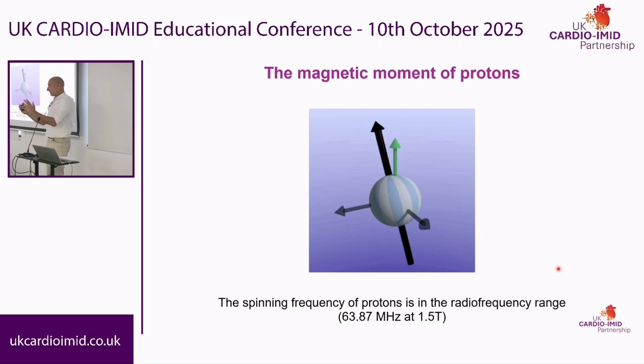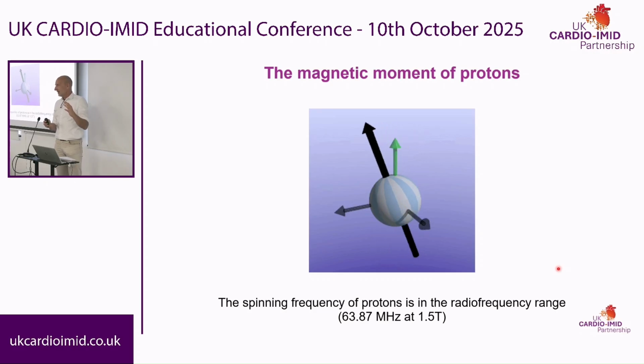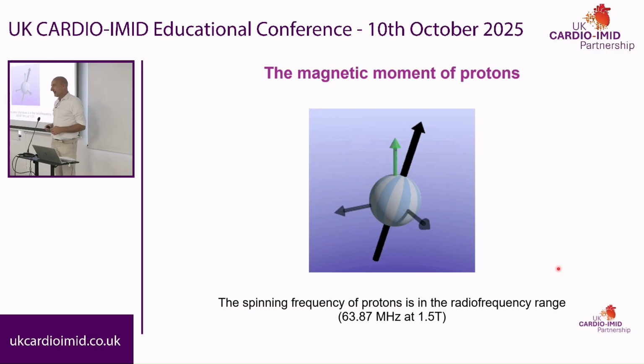So the first part of the MRI scanner is the very strong magnetic field, which we need to do what? Align protons with the magnetic field, so they're not all chaotic and don't give us any signal. You can't really work with that. Everybody doing their own thing doesn't work. Second thing of the MRI scanner is the RF pulse. So we've got them all aligned. Now we have an RF pulse.